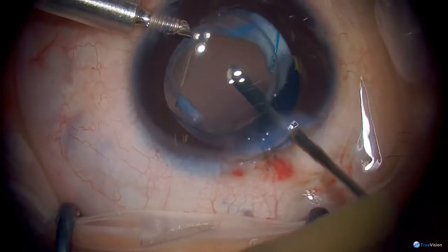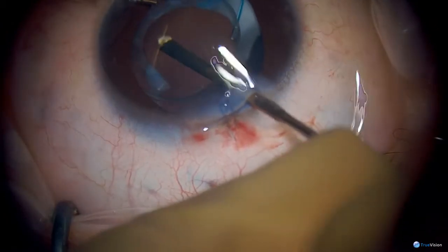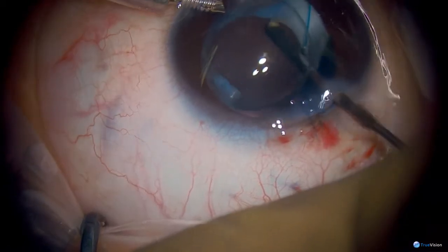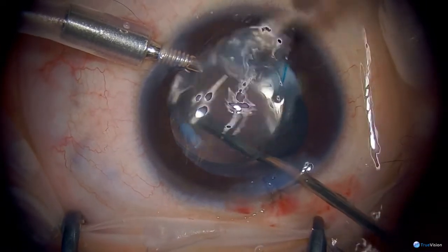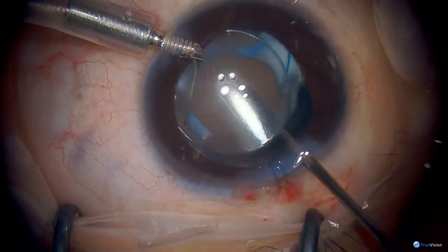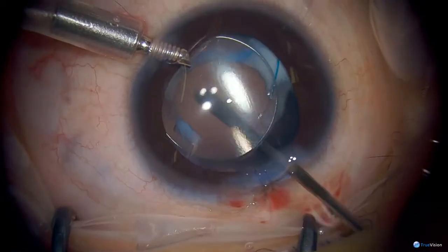And there's some whitish areas in the red reflex here, and I can't see what they are. They're fairly posterior, so I'm not going to go after them. They may represent old blood or very old vitritis. I can't tell. Sorry, you see blood in the vitreous? It might be, yes. But it's very far back, and I don't have a view. So I'm only going to go after what I can see.